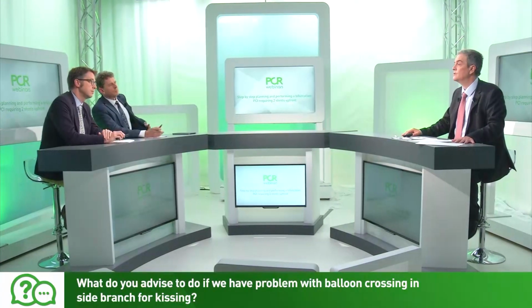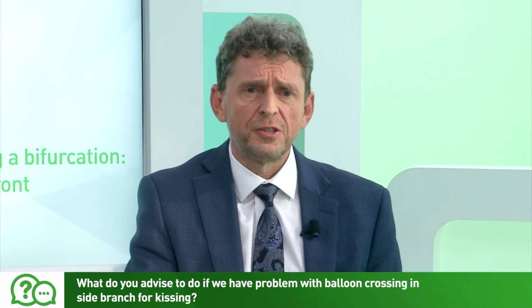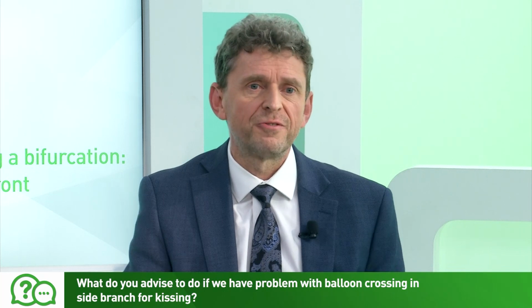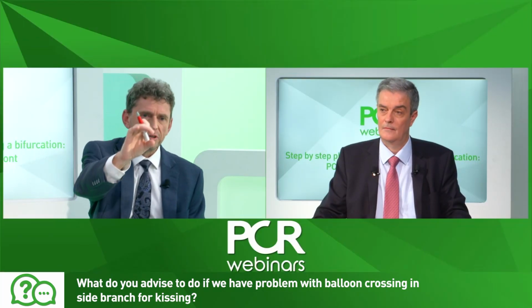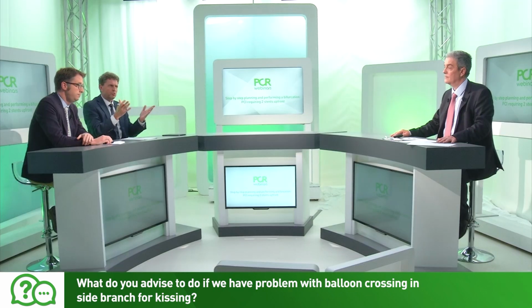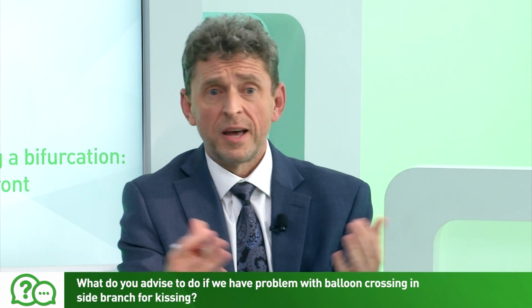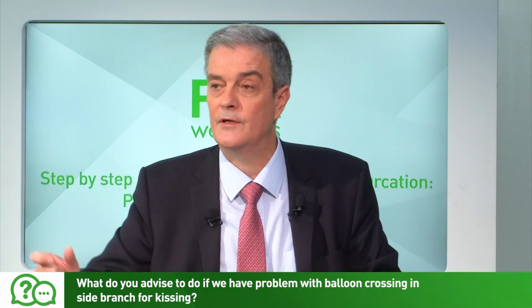Yeah. What do you advise to do if we have a problem with balloon crossing in the side branch for kissing? Yeah, there are lots of options. A couple most frequently used. What I do, having two stents in the vessels, you can very easily and very safely perform an anchor technique. So you can park your balloon in the main vessel, open the balloon. You have an 8 French catheter, but you can do this also with a 6 French catheter. Inflate the balloon, make an anchor to your guide, and then you can very easily recross, if distal stenting allows you to position the balloon inside the stent.